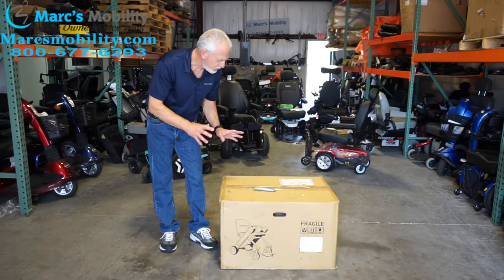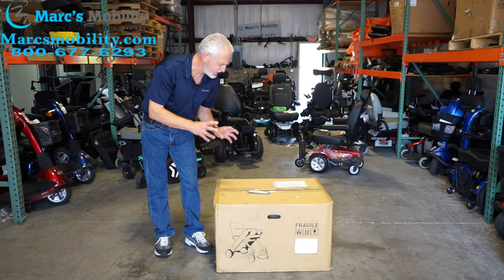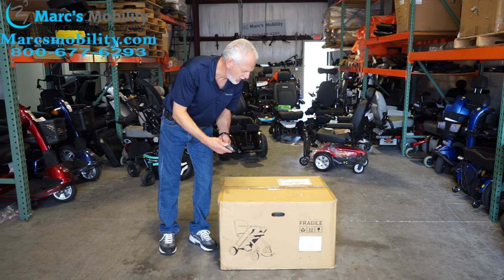We have here the Power Wheelchair, the Will FI Powerchair model. This is the Folding Will FI Powerchair — how to unbox it.